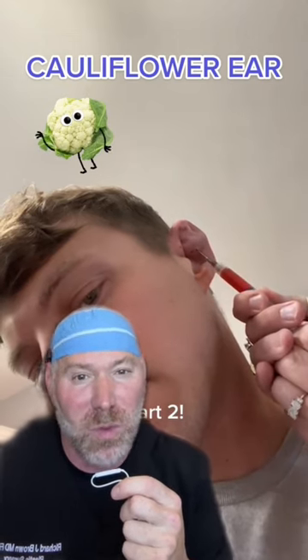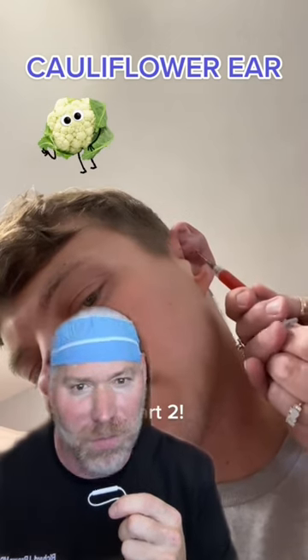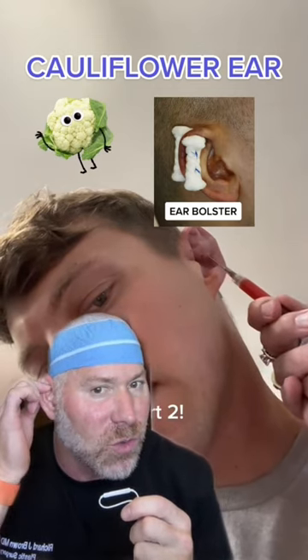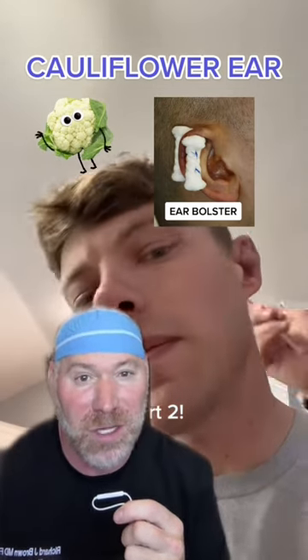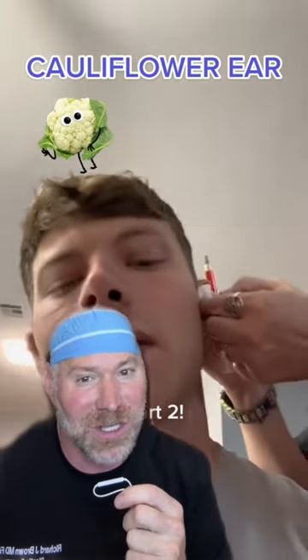The other reason why you really want to let a medical professional do this is because at the end, when we draw all the fluid out — and you want to take it all out, don't leave any behind — we suture what's called a bolster dressing through the front and the back of the ear to hold compression, because if you don't do that the liquid collection will just come right back.